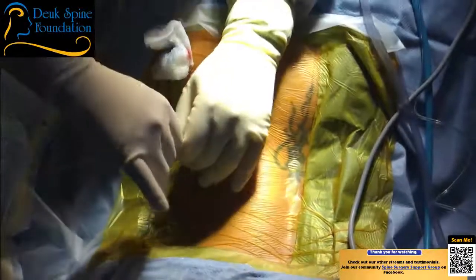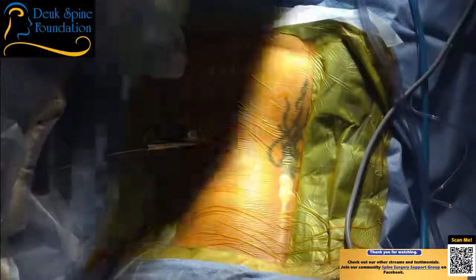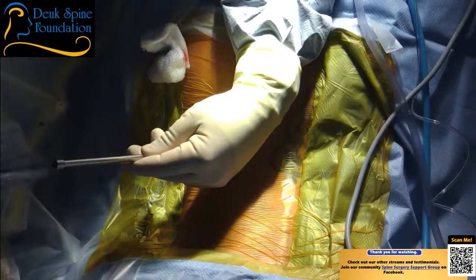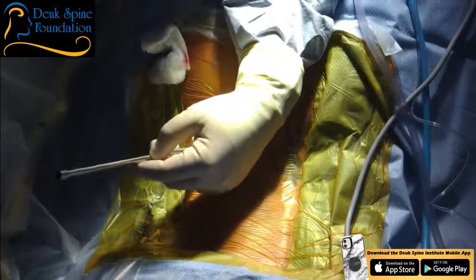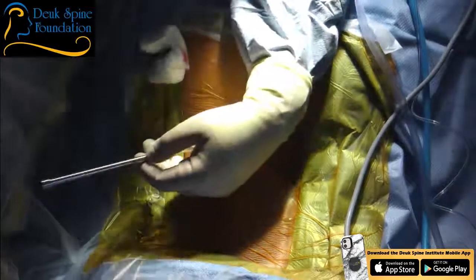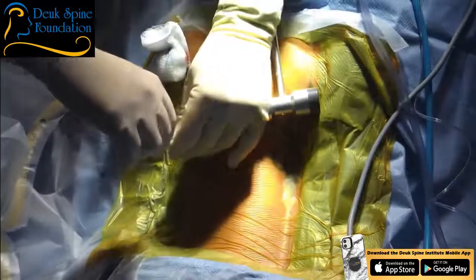It's nice. So we're inside the foramen, right at the back of the herniation. This is going to be a more stimulating area for the patient because this is exactly where her pain is coming from, this herniation right here. I'm actually touching, with the tip of that metal device, the part of the herniation that hurts, which is why it's so uncomfortable for her, because we're on the part of the herniation where all the pain comes from.